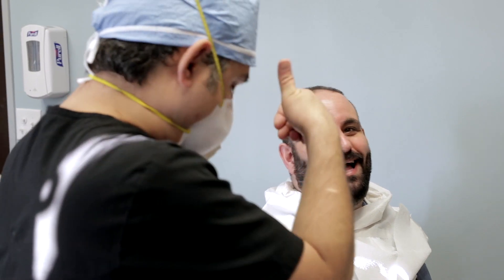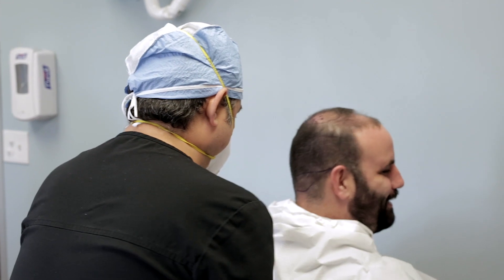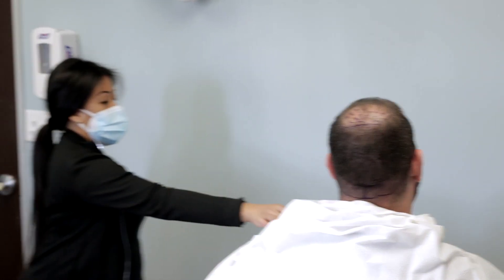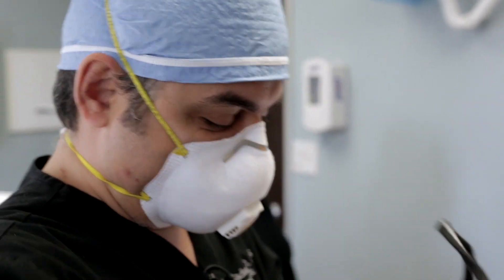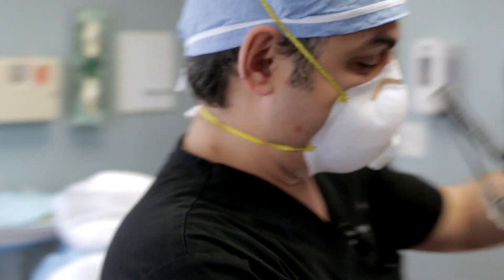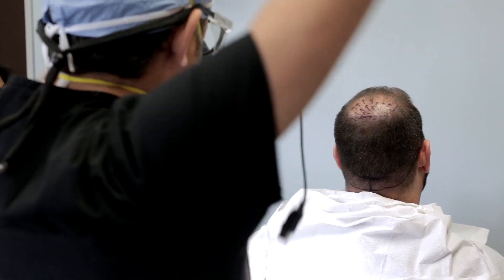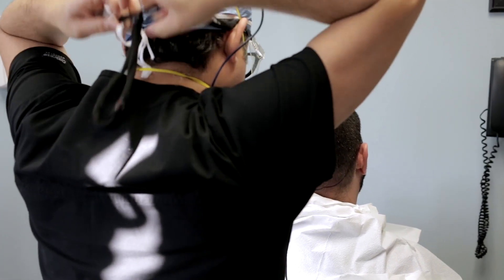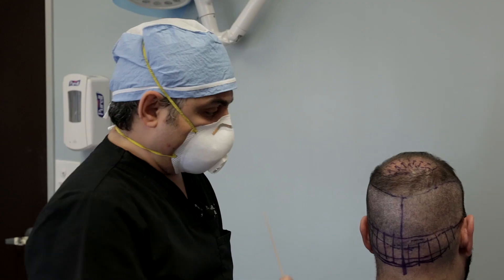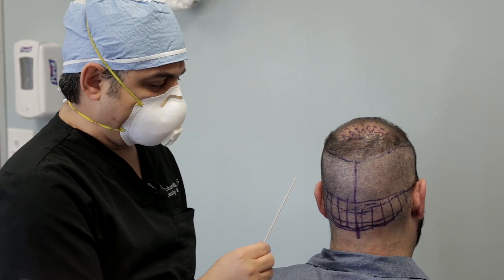The patient mentions we could even take from the beard for a future session — that would be session number three. Using growth factors will help a lot, though each time you harvest from an area you get a bit less. I just shaved the back of the scalp — about six weeks ago we removed 2,500 grafts, and today we're going to remove another 2,000 to 2,500.